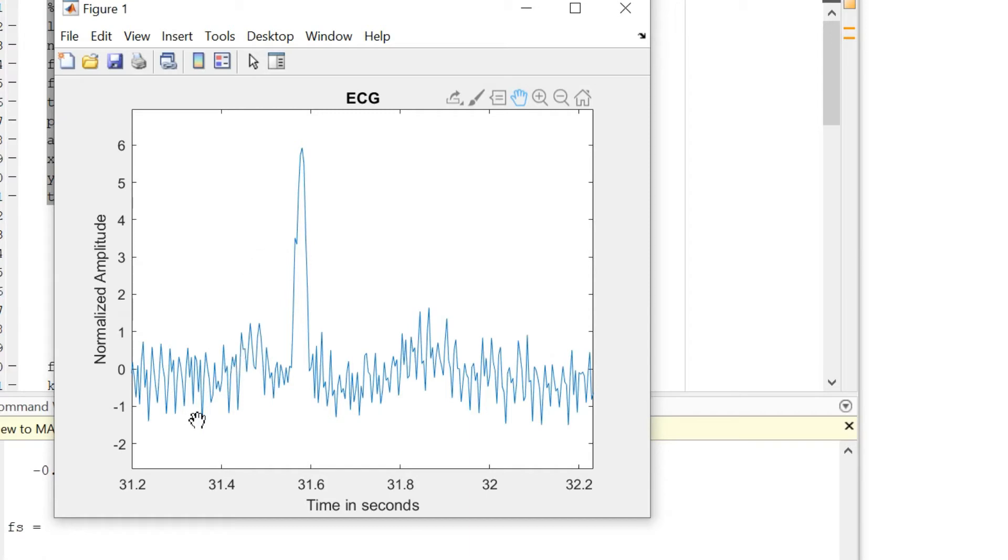However, for the current purpose we can still work with this data. You might have a much cleaner signal which will work in your favor.